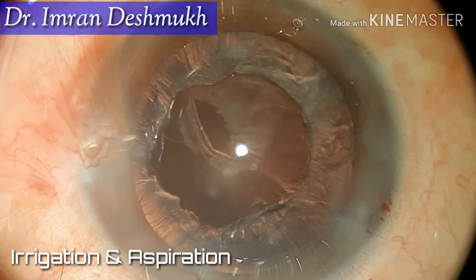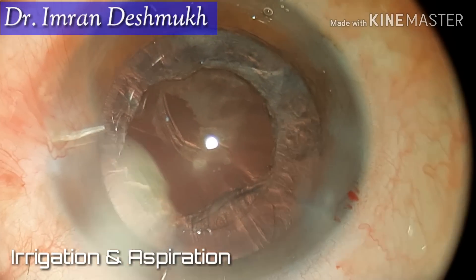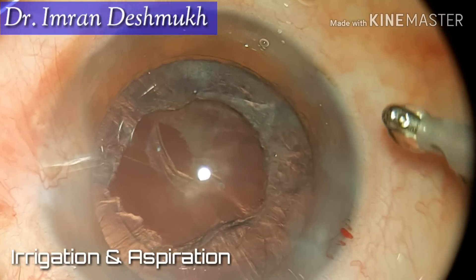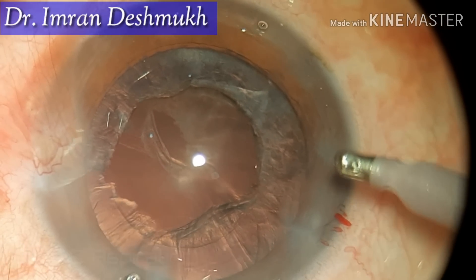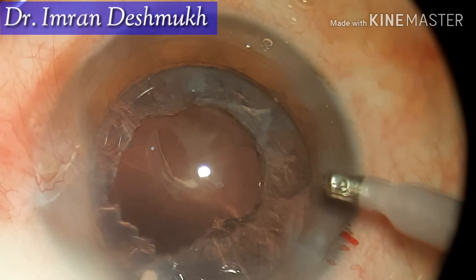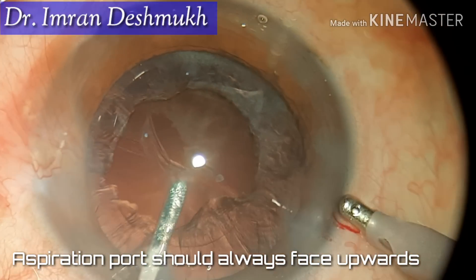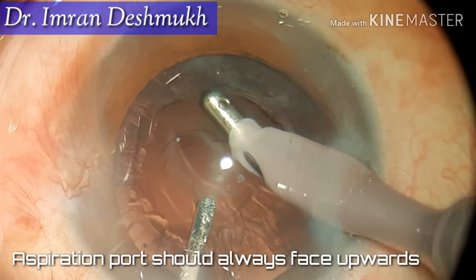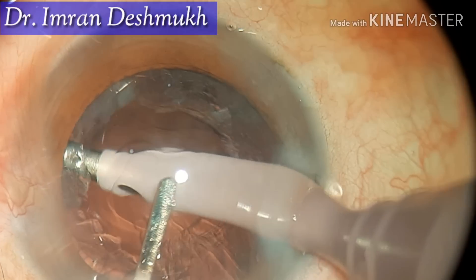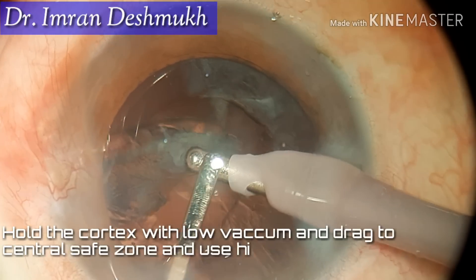The important part when doing IA is: once you insert the IA tip, make sure the tip is facing upwards. Never use the IA tip sideways or downwards, as that can catch hold of the posterior capsule. The aspiration port should always be facing upwards.